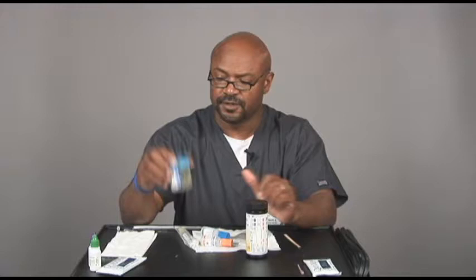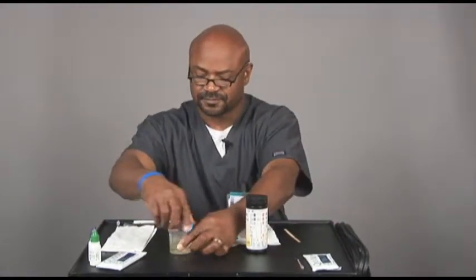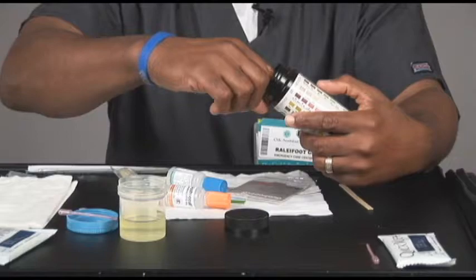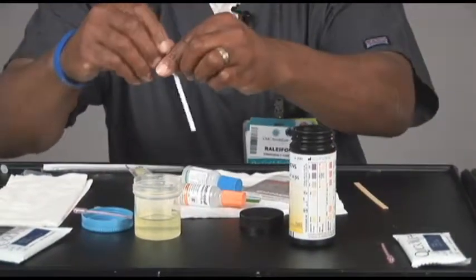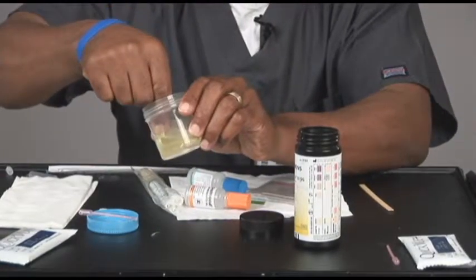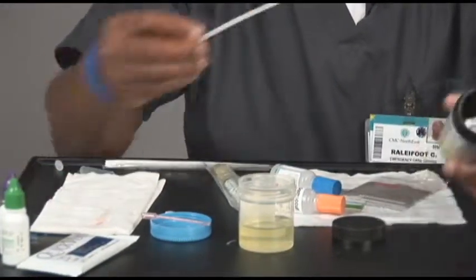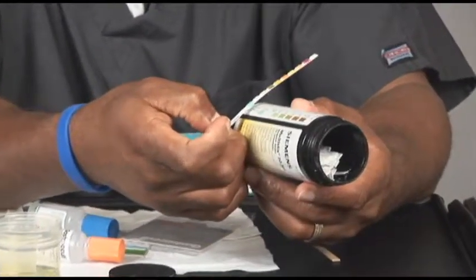First, we're going to start with a cup of urine here, which isn't real. You get your urine out, always wear gloves. You get one of the multi-sticks, dip it down in the urine completely, and you can dab off any extra urine there, and you're going to compare the colors to the results.